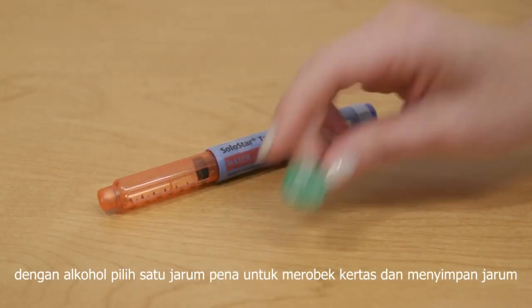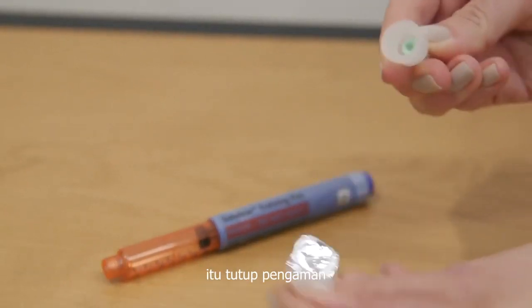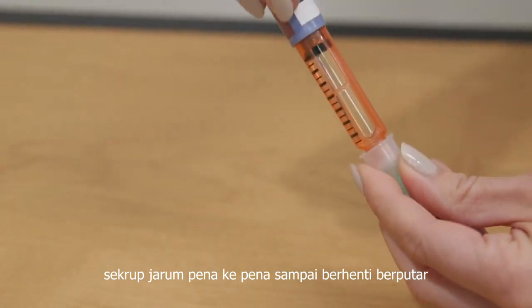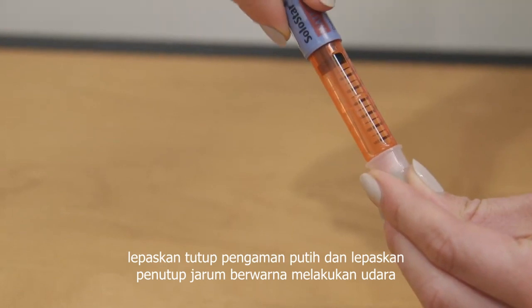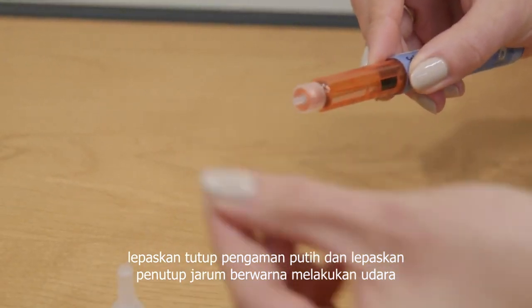Choose 1 pen needle. Tear the paper off and keep the needle in its safety cap. Screw the pen needle onto the pen until it stops turning. Take the white safety cap off and remove the colored needle cover.